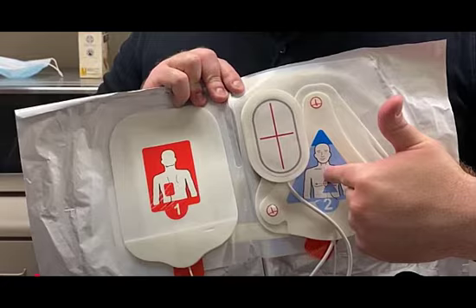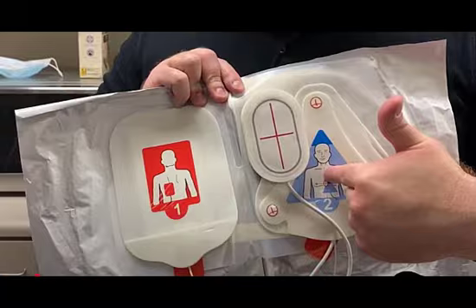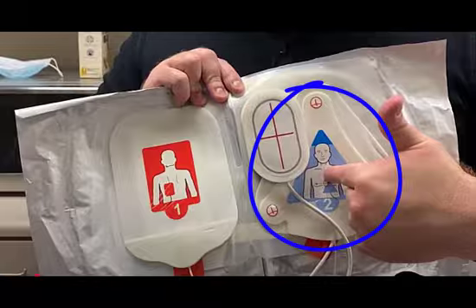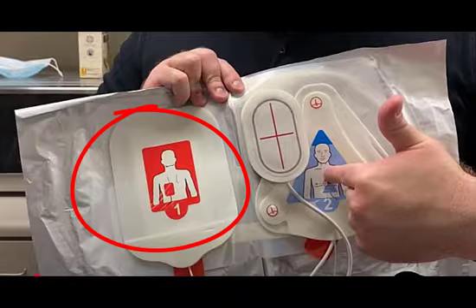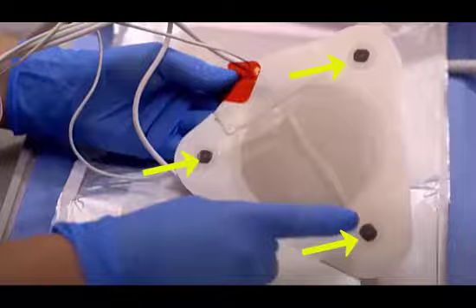Now, attach the pads. They're color-coded, black or blue at the front, red at the back. Put the front one on the left anterior chest wall, where V2 and V3 would be. Put the other pad on the back between the lower part of the left scapula and the spine. The monitor I'm used to, the Zoll R series, has a built-in 3-lead ECG, so you don't need a separate one to read the patient's intrinsic rhythm.